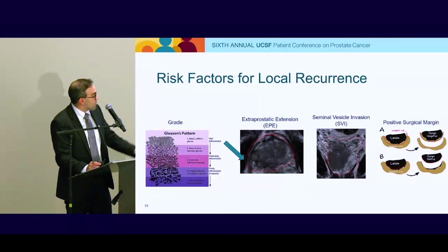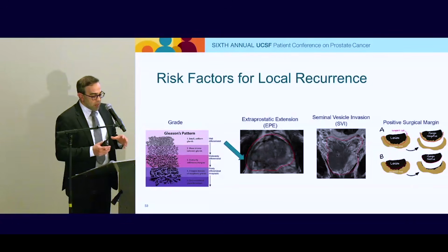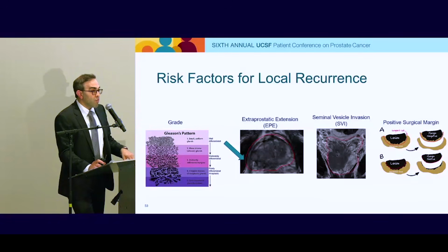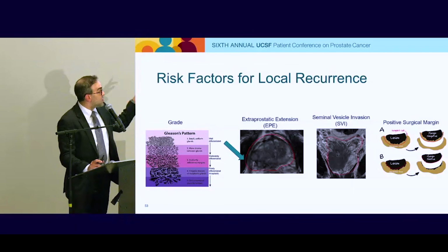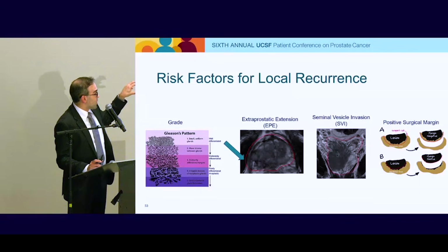The next two slides pictures I have there are of MRIs, similar to what Dr. Barrett showed earlier about prostate cancer, and the utility of MRIs is, prostate cancers like to extend beyond their capsule, right? This kind of means that they're a little more aggressive. Now, to be clear, that doesn't mean it's metastasized. This is a local phenomenon, right? But often what we see at the time of surgery, there might be a little extracapsular extension that wasn't even seen on the MRI. In this figure, it's pretty obvious. I outlined the prostate there in red, and the arrow is where I plan to point the prostate cancer bulging a little bit on that left side in that dark figure, right?